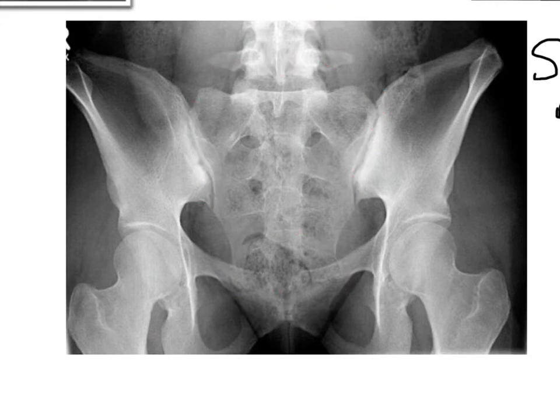All right, so now that we've talked about poop and everything else, let's move on and talk a little bit about how do we know if this is a good image or not. Did we position our patient correctly? Well, let's look at the spinous processes. Are they within midline? I see 1, 2, 3 right here. They look pretty much in midline to me.